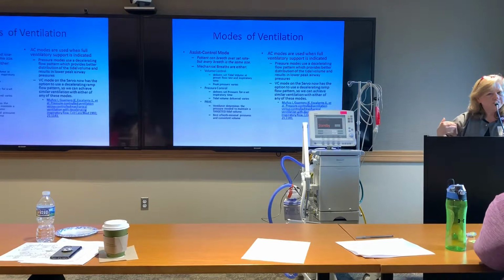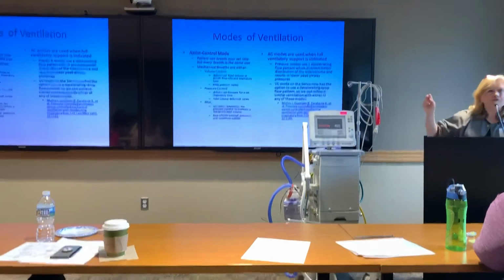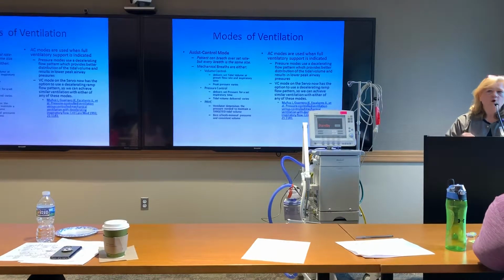therapists, different doctors have different beliefs about what mode is better. No mode is better. No studies have ever shown that any mode of ventilation is superior to another in general. I can do assist control ventilation using pressure control or volume control or PRVC. It just kind of depends on my personal preference.